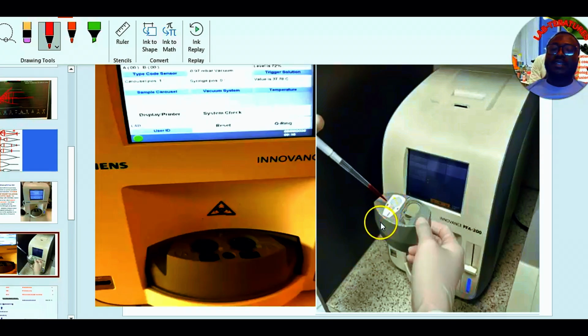One cartridge has the epinephrine and the other cartridge has the ADP, but both cartridges have their inner linings lined with collagen, which means both of them will have collagen. Now, under shear pressure, when we say shear pressure, it is the pressure at which blood moves platelets toward an injured tissue, and that shear pressure activates platelets. So the manufacturers have mimicked that shear pressure by forcing your sample that you are pipetting into this cartridge to be forced through an aperture.